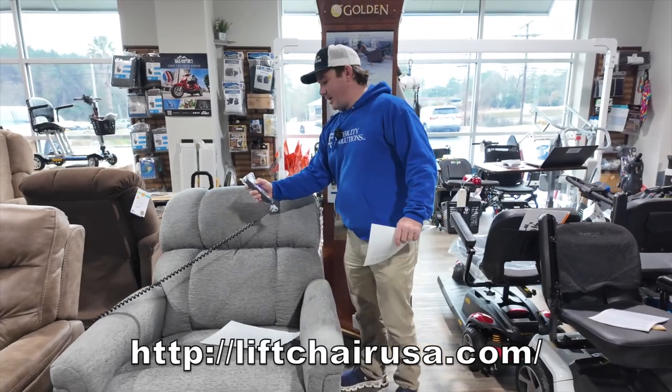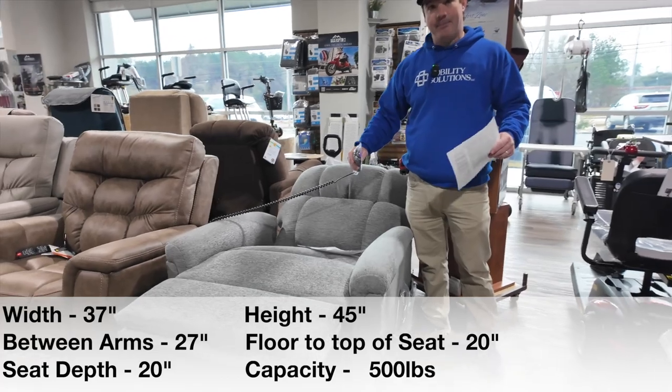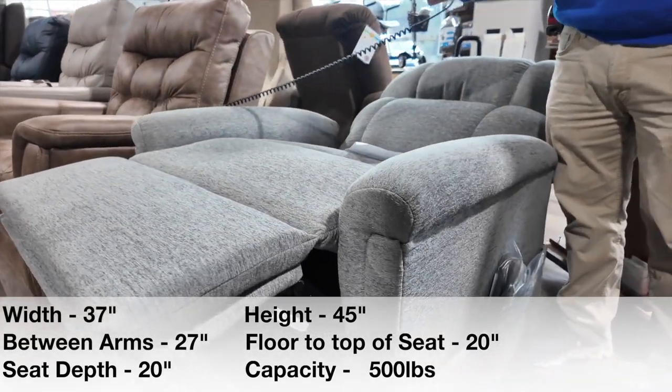This chair is very wide — between the arms it's about 27 inches, and they make a larger one that's 29 inches with the Maxi Comfort.